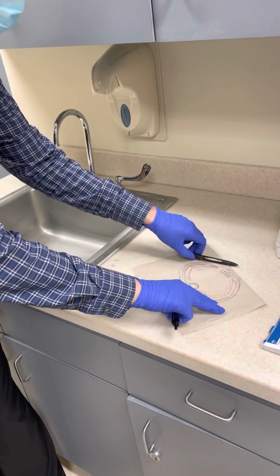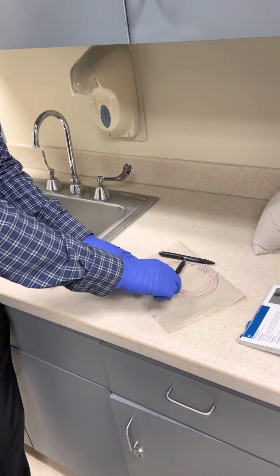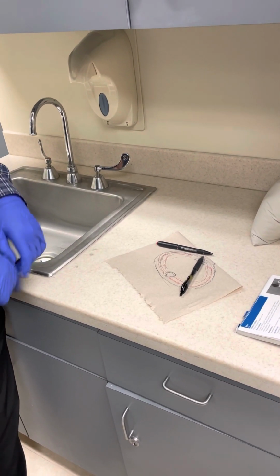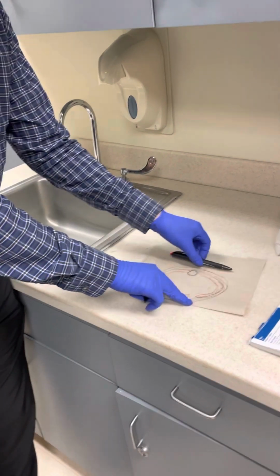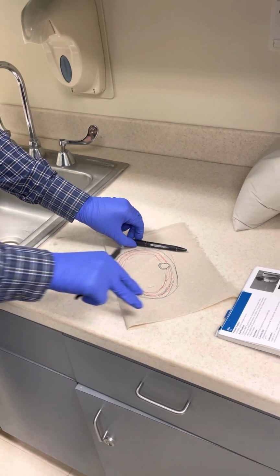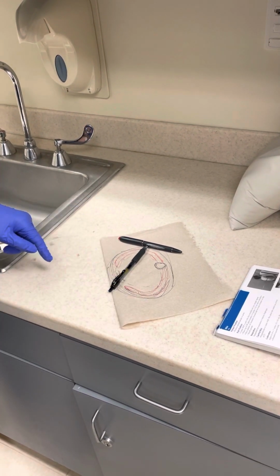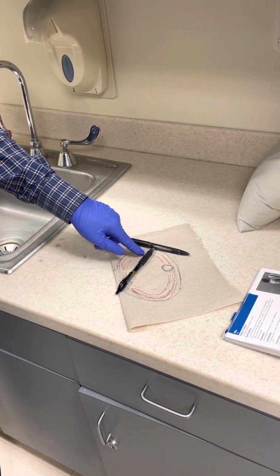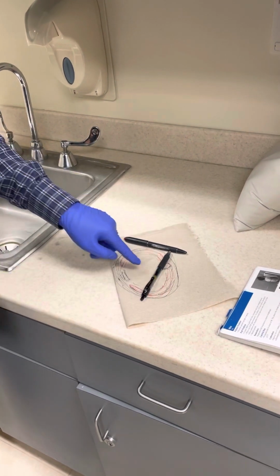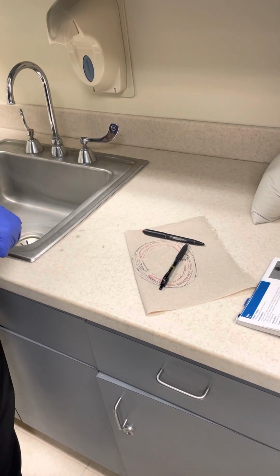You flip this around, right? Now this is an LAO, right? Now the spine's on top of these left ribs, and the right ribs are the ones without superimposition. Make sense? But what if this was posterior? What if the IR was back here? Then RPO. So RPO, right? Here's at the right. So X-rays come here, no superimposition. So which side are we looking at? The right. The right side. If we look at the patient's left side, notice what superimposes the ribs. What is that? This. That's right. Once again, it's the spine.